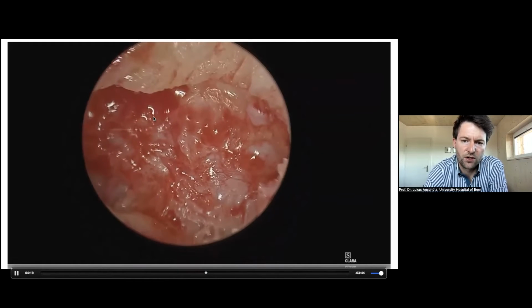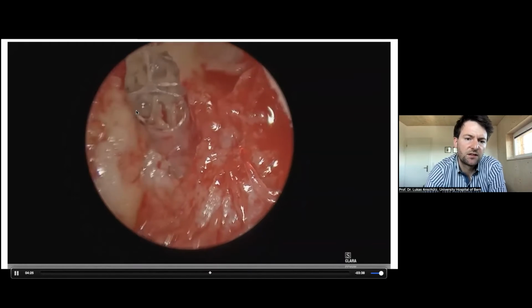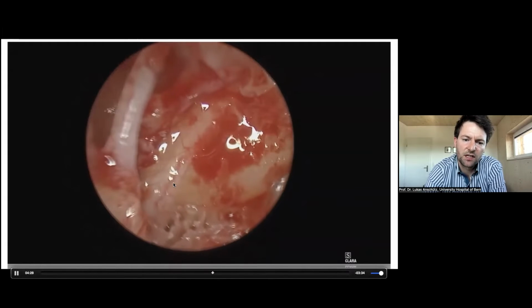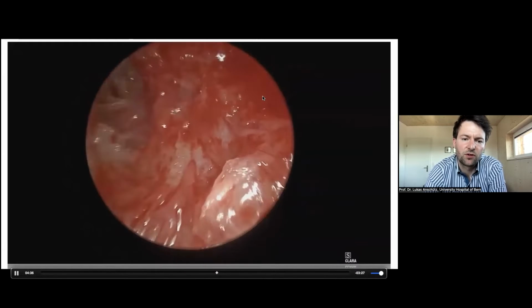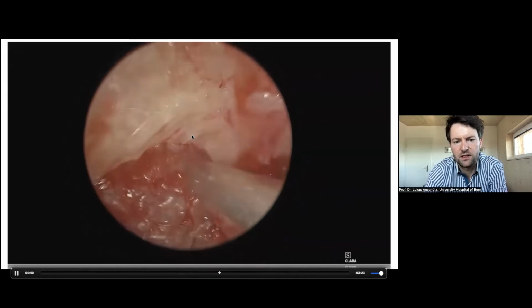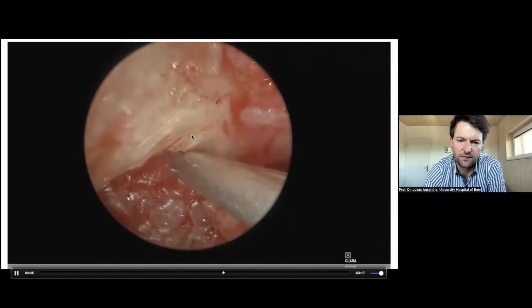So the cholesteatoma goes away, and now I look into the antrum with a 45-degree endoscope. You can see here, this is the Körner septum from below. This is the lateral semicircular canal, facial nerve, and the tegmen. And we can check if there is some more cholesteatoma. And there is actually one small piece, you can see it here, of cholesteatoma, which can be removed with a suction under visual control.